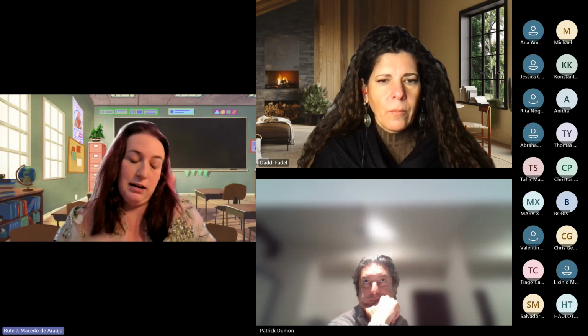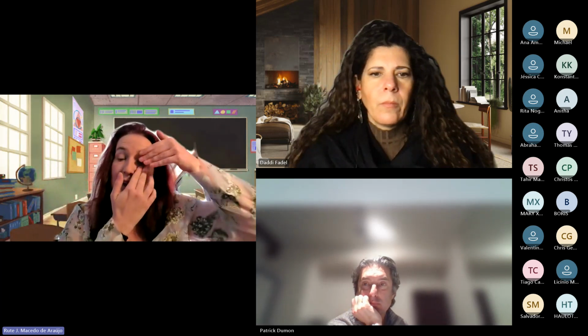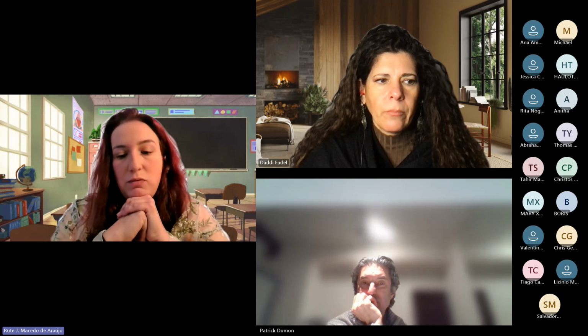My microphone was off. I would suggest using a stand for the plunger. There are many tools that will help you and the patient to insert the lens on the eye. If you have a stand for the plunger, the patient will have both hands free, and that can help them to open the eye wider. And if that doesn't work, I would suggest decreasing the diameter. But I don't like lenses smaller than 16 millimeters, though it could be an option depending on the case. In my practice, when patients have problems inserting the lens, having a stand with a plunger helps these patients a lot. I don't know if it is your perspective as well, but for me it helps a lot.